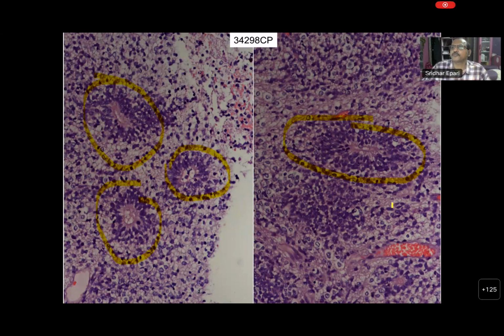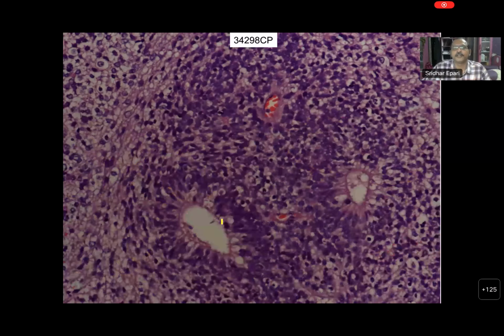Earlier these tumors used to be called ependymoblastoma, and now they are renamed embryonal tumor with multilayered rosettes. That is the poorly differentiated spectrum. This is the other, but both are a similar spectrum and molecularly one group only. You can see the same higher picture of multilayered rosettes. I did not give a classic case.